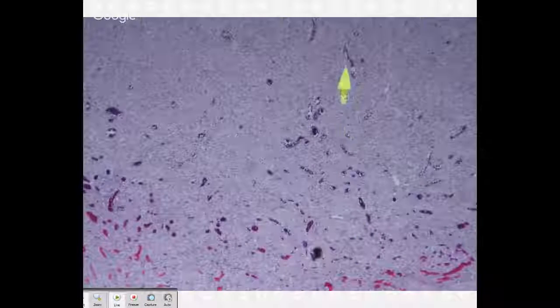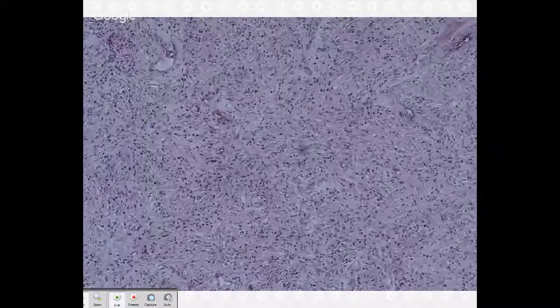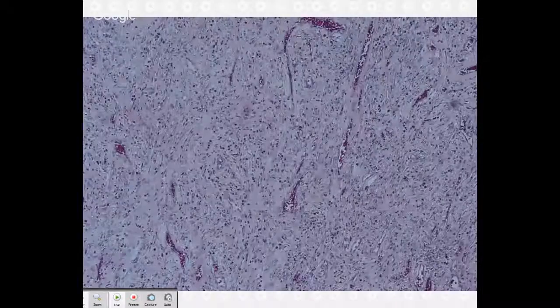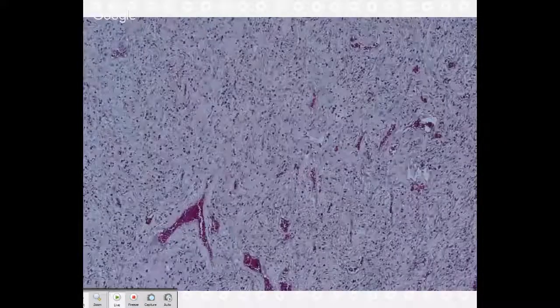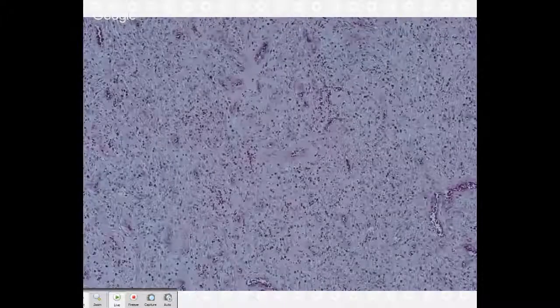They're prominent here because they're still filled with red blood cells. So you do have good vessels, and tons of eosinophils, and again those spindly cells. And these spindly cells look even different from the past two inflammatory fibroid polyps that I've shown you. So you have to put everything together. You can't hang your hat on just one diagnostic criterion, but submucosal base, spindly cells, eosinophils, prominent vasculature. If you see onion skinning, that's great. That probably would be a picture they could show you on your boards, with some nice onion skinning.